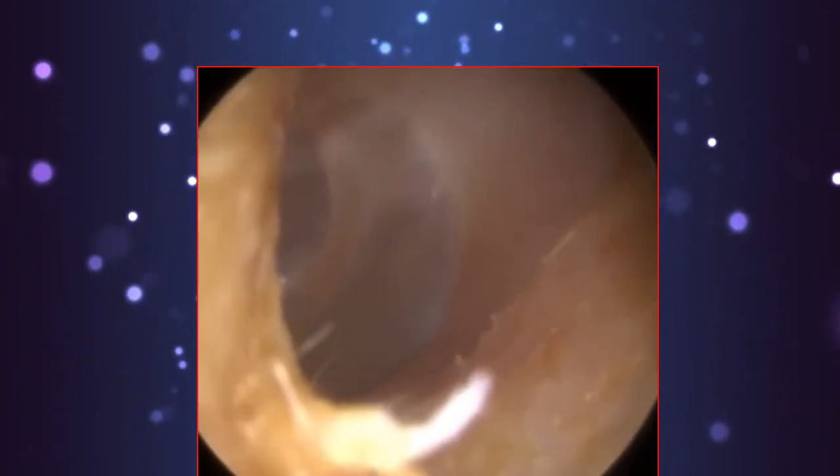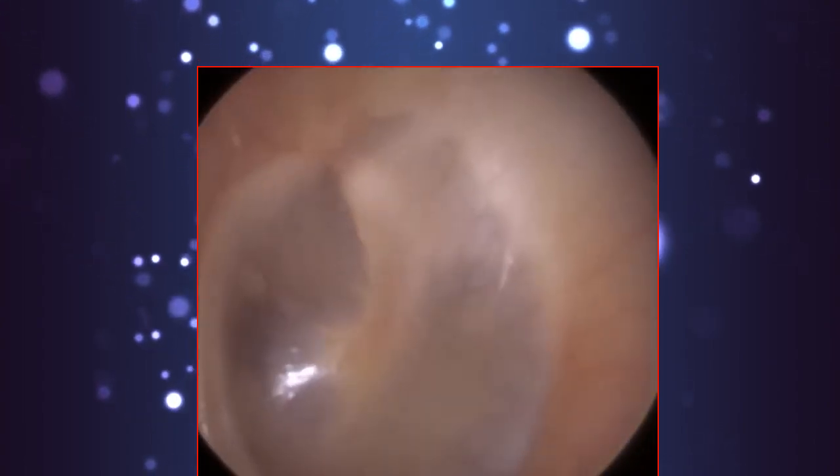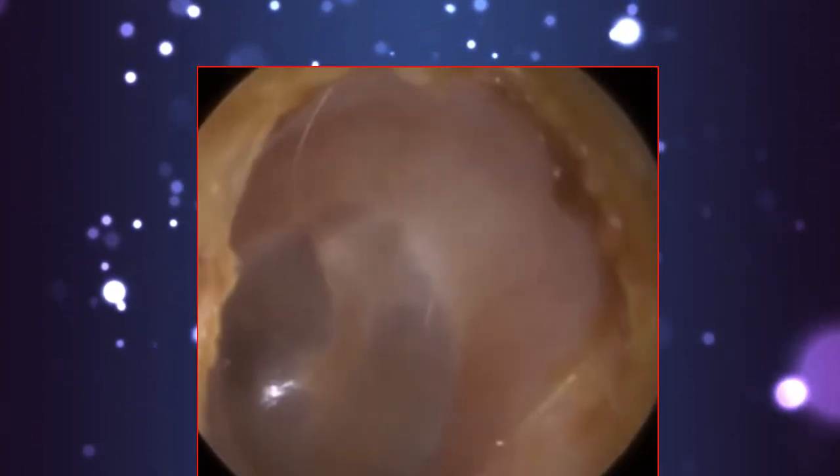You just see how dark that is, so that's been there for a while, it's oxidized. So again, more medially, the ear canal is really healthy. There's a lovely view of the eardrum, which is nice and healthy. The canal wall, medially, on the bony part, looks pretty good. It's just more laterally here. You can see all this dead skin, and it's really, really frustrating for the patients. Itchiness is something that they suffer from chronically. It can really get them down.